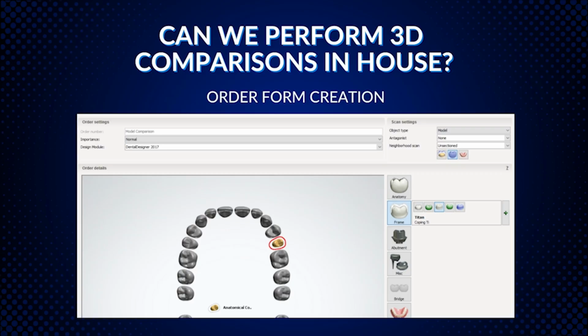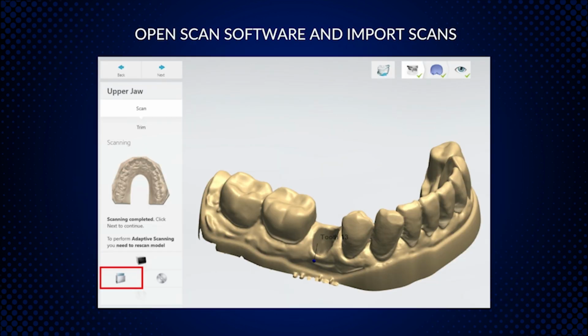I like to set this up in 3Shape. As you can see on the screen, I usually just use a coping, a simple coping, and then I'll add the little purple tooth up there in the top right. That's for a pre-preparation scan, right? So I'll go ahead and select that, and then what I'll do is scan the model that I've just printed. In the scanning software, once it is scanned, I can also load the original STL file that I did print, right? So that's my pre-preparation. You'll see in the top right, it's that little purple tooth.